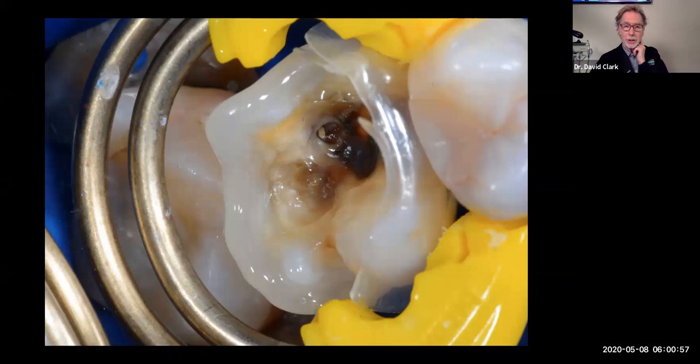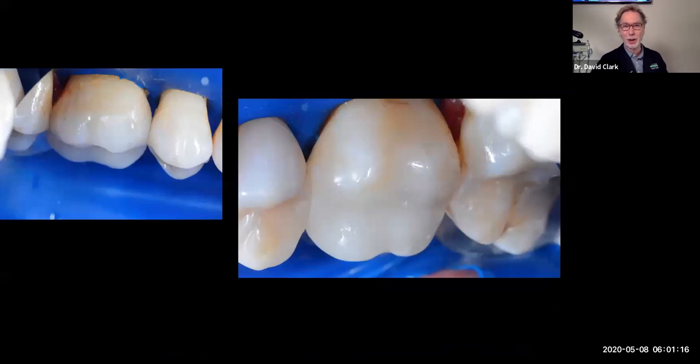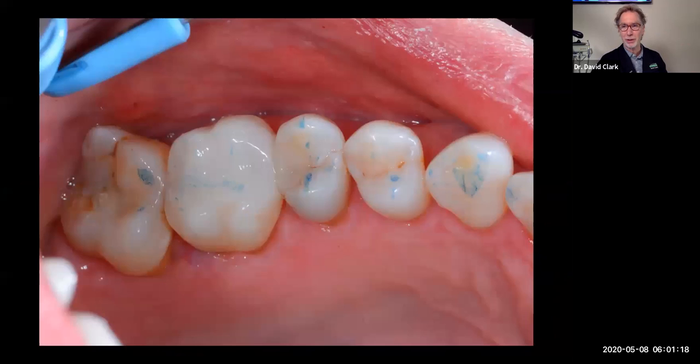All right, so there we are. Now we put the tooth into compression. Pat loves his tooth. There was a prosthodontist, a friend of his, who wanted to put a crown on there, and Pat says, no way, I want an overlay. He walks around telling everybody he chews on nuts, and he's trying to break this tooth, right? And it's super comfortable. So these are compression-based restorations.